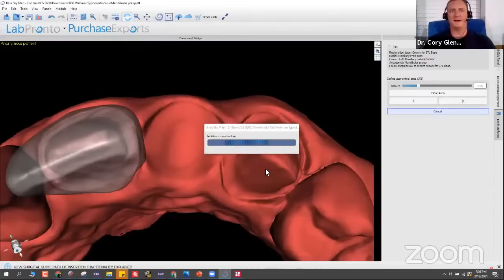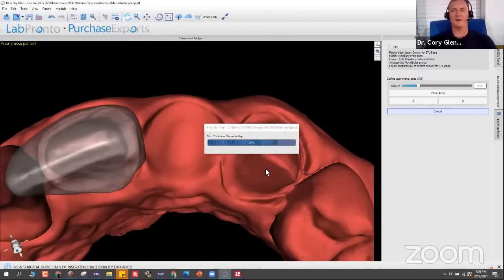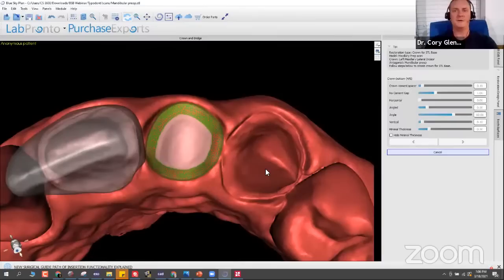Again, the resin that I'm speaking of, the only one that's approved in the U.S. right now that I'm aware of, is made by Bego, B-E-G-O, and it's called Varseo Crown. So you can very easily go online and look at any kind of packets that they have for that.